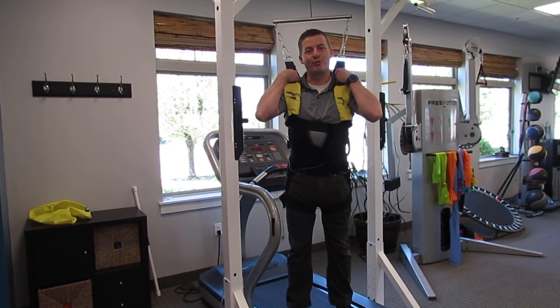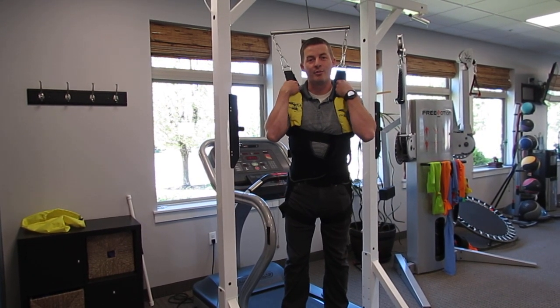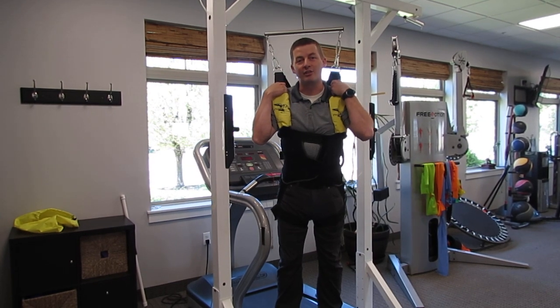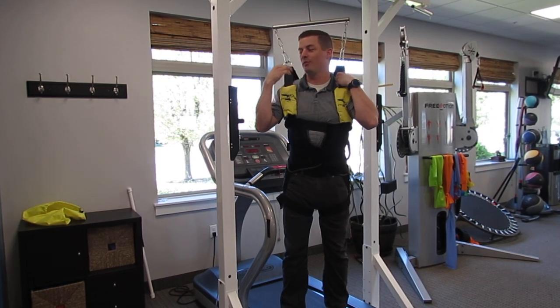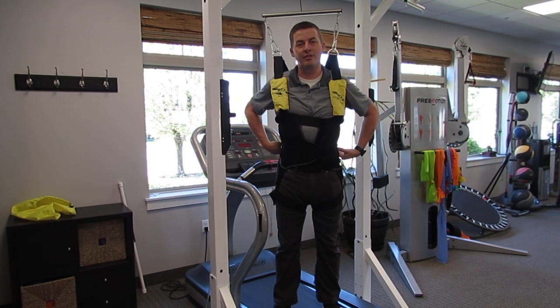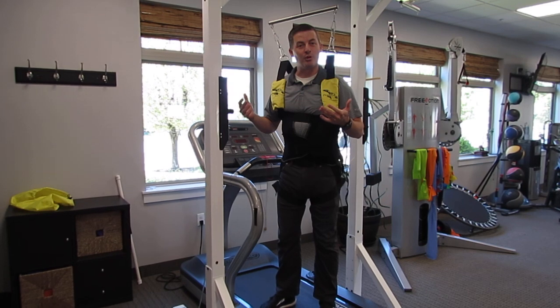Pneumatic unweighting — we've had this system for a while. It helps for those who don't want to do aquatic therapy, either because of a fear of the water, a fear of the bathing suit, or just logistically it doesn't work. We can hook someone into this harness to take load off of the legs and even some load off of the back.